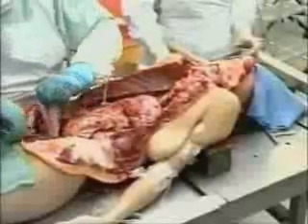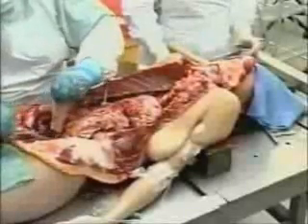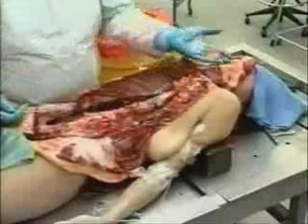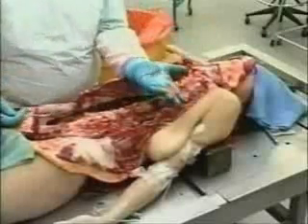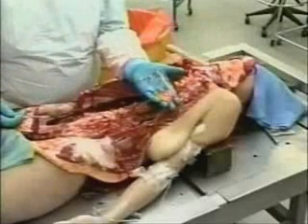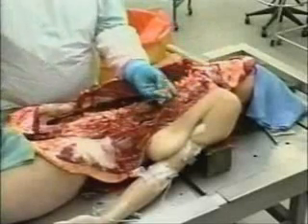And there we go. That's an adrenal gland, which he's dissected off the top of one of the kidneys. Is that the left, Dave? Right. Right, yeah. Okay. Right.